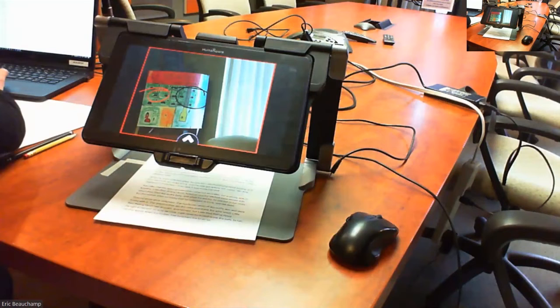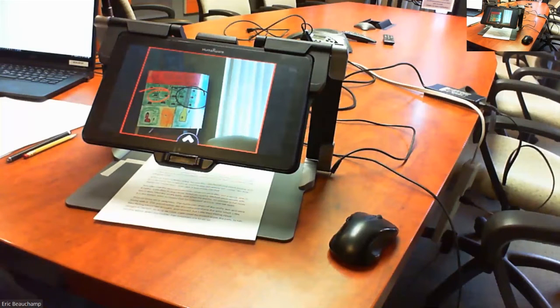I personally wouldn't. Yeah, so I personally would never want the camera to record video in the school environment with all the emphasis on personal identifiable student information. Well, see, so that's an opinion that goes in the same direction that HumanWare took when we designed this application for the distance application.